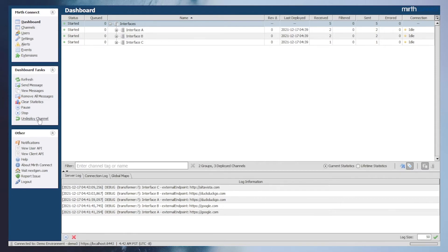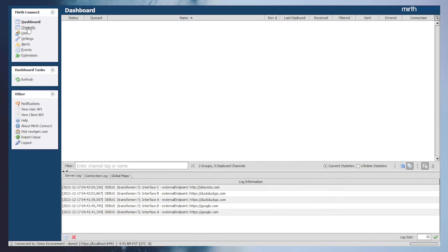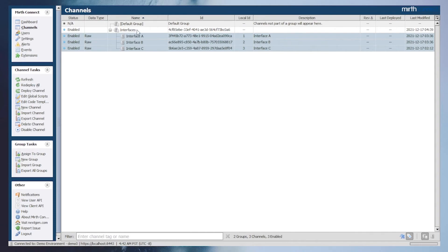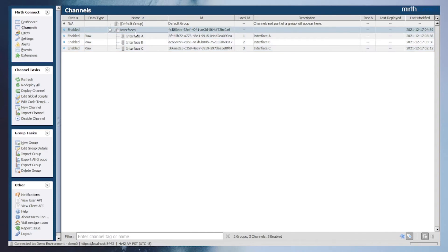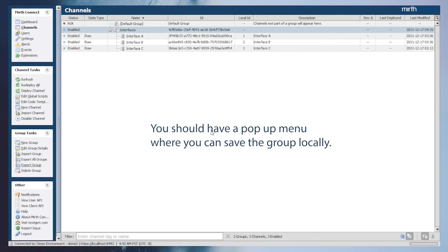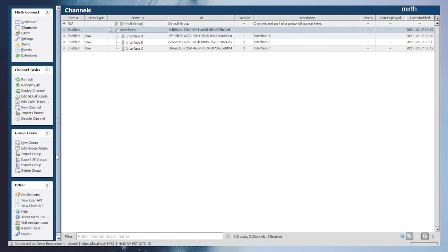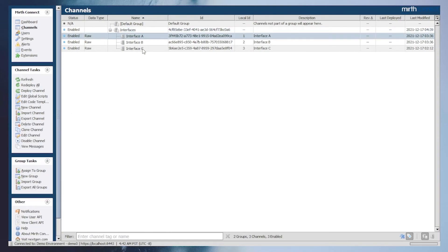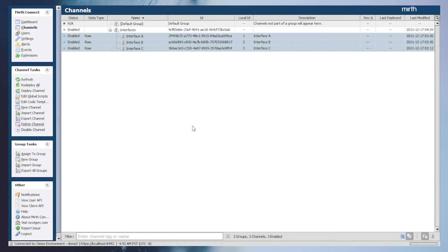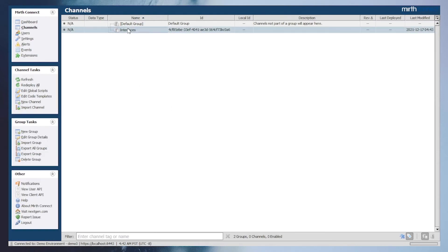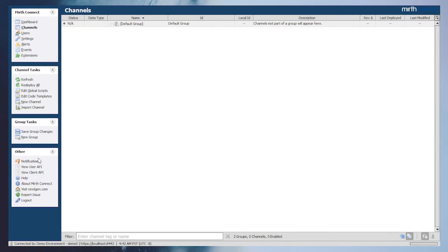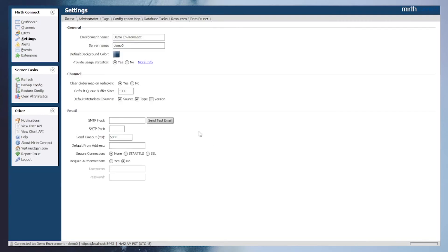We'll start off by undeploying the three interfaces to show that nothing is deployed in the dashboard. Next, we'll export the interfaces channel group by clicking export group and saving the export locally. Since we're using the same environment to act as a secondary MirthConnect server, we will delete the interfaces that we just exported along with the channel group. Again, this step is not necessary if you were deploying to a separate MirthConnect server.